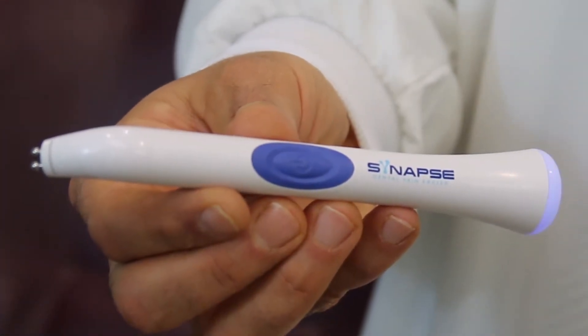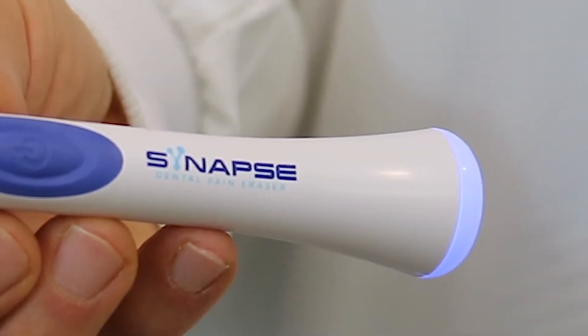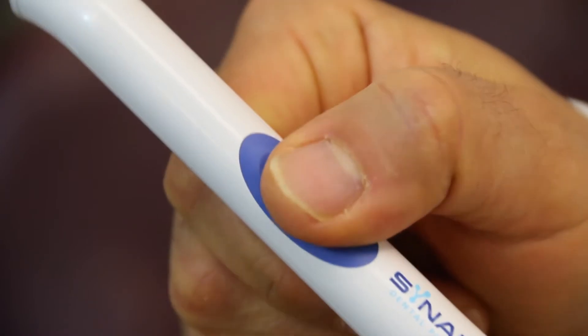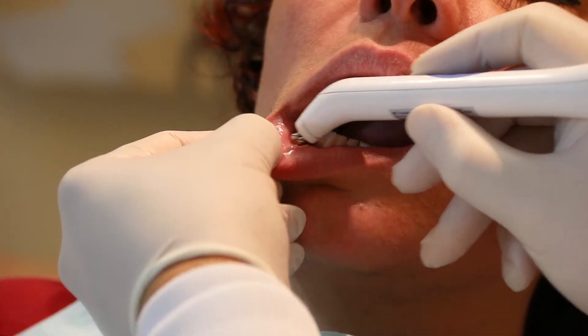A new age of oral care is here with the Dental Pain Eraser, an amazing pen-shaped device that offers patients immediate drug-free pain relief.